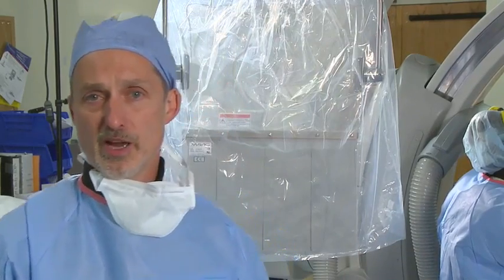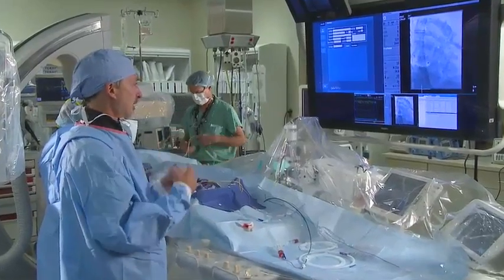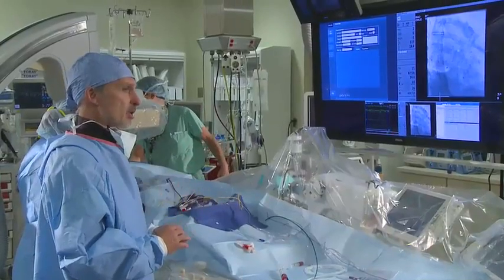So the additional time to set up the team with anesthesia and the echo team, to me, is often worth it in terms of getting a great result and having confidence. The value increases even more proportionally as we get larger and larger ASDs, where we have 2 ASDs. The more complexity, the more this approach makes sense. So the integration of X-ray and ultrasound is only in its beginning. We'll hopefully see in the next couple of years a lot more tools that will come along that will help us.